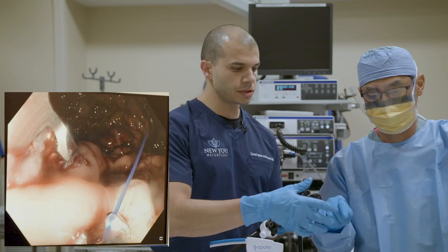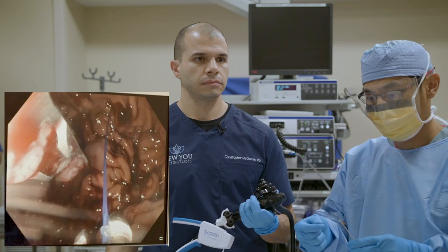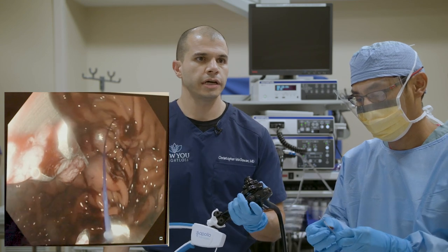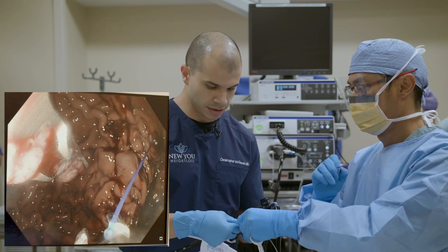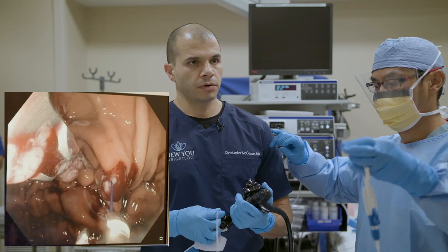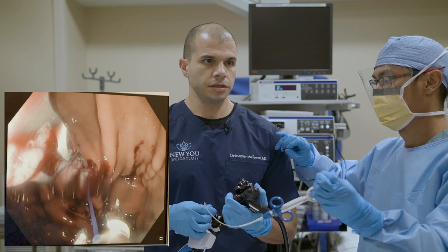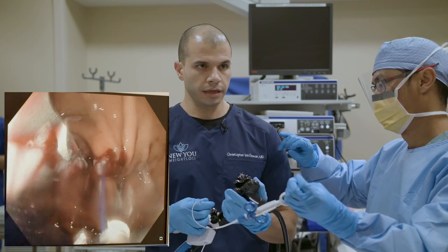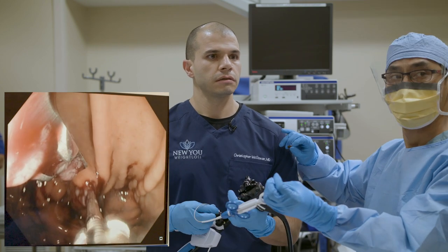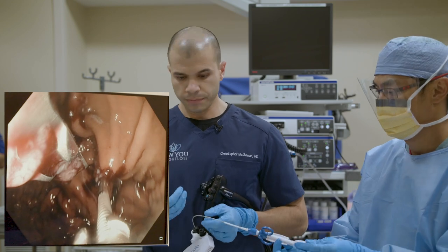We're getting ready to cinch this suture. Question from Julie: why does alcohol affect the stomach in minimal amounts? That's really only true in the beginning — the first week or so you're probably only consuming up to 500 calories a day, only on liquids, and you just really can't tolerate alcohol in that beginning period. Once further along, it's certainly reasonable to have alcohol in moderation — we typically want you to wait maybe six months or more.